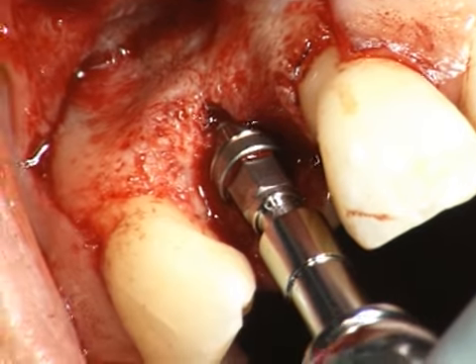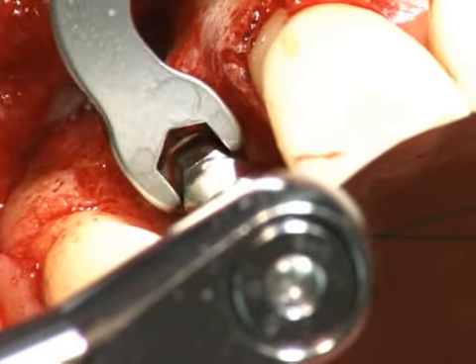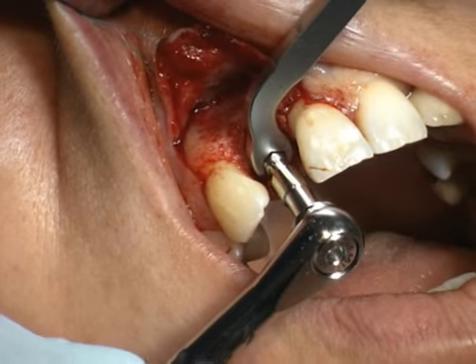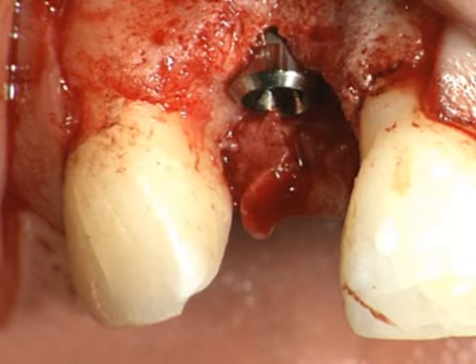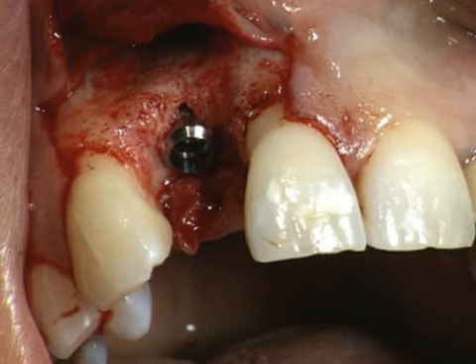After the final position is reached, the holding key is removed and its forked end is put on the hexagon of the transfer part. To release the transfer part from the implant, the arrow on the ratchet must now be set to counterclockwise. The screw connection is released and the transfer part is removed. The final vertical position is reached when the implant shoulder is situated at the same height as the enamel cementum margin of the adjacent teeth. The implant should be surrounded by a layer of bone at least 1 mm in thickness. The small marginal recession is later augmented with autologous bone chips.